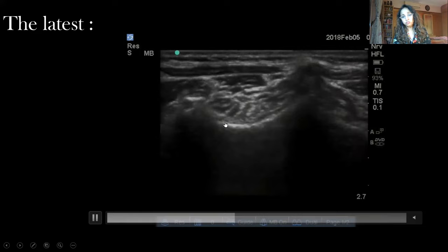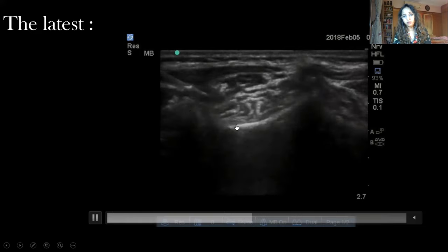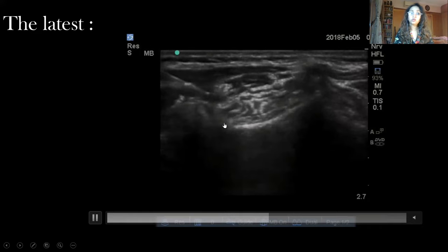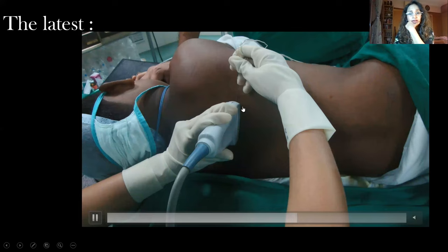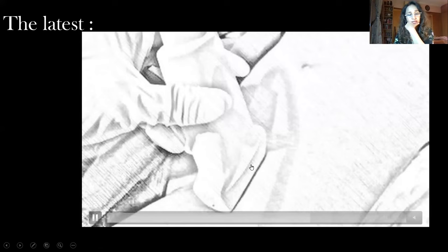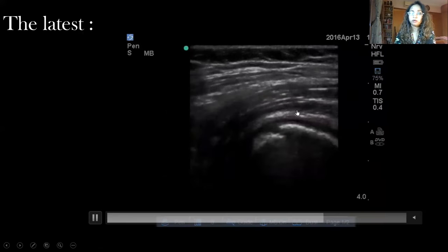If you want to see at the level of the laminae, then this is how the needle will come in, at the tip of the transverse process or towards the lamina. This is how it would happen. This is the erector spinae. Paravertebral, again, lying down. This is the typical paravertebral space. And this is the block that we really practice very often, the fascia iliaca compartment block.